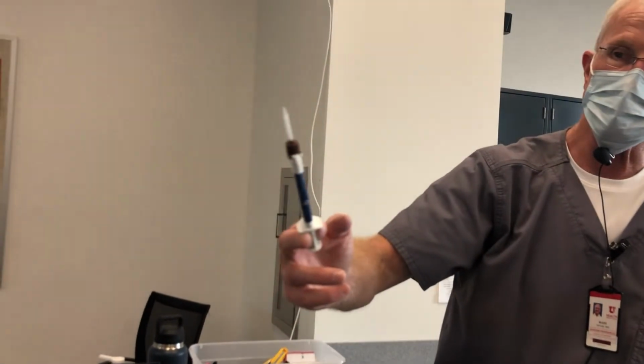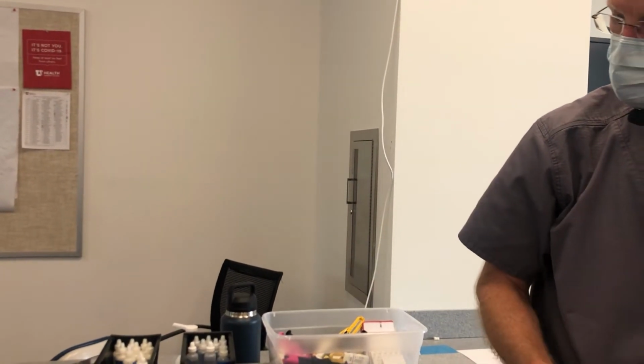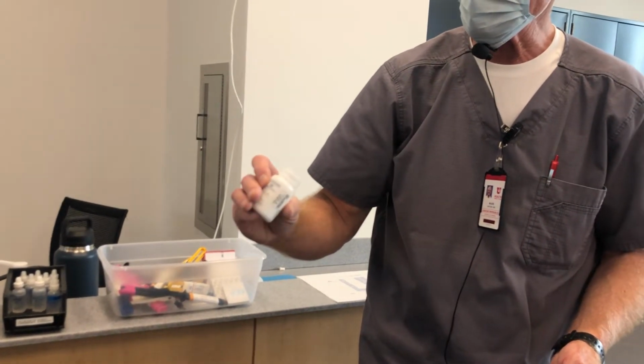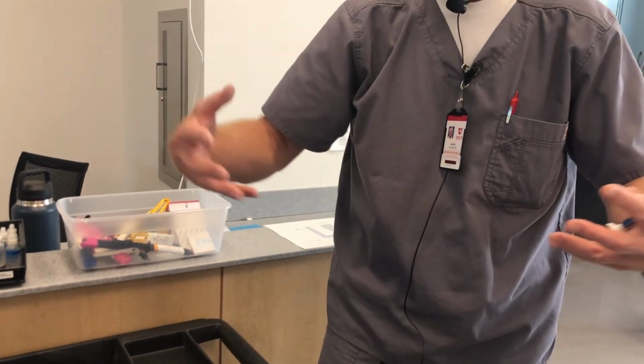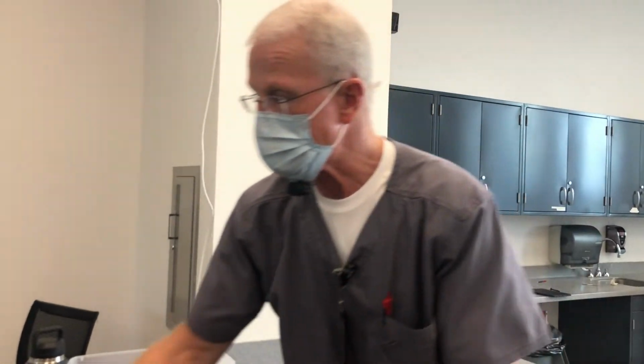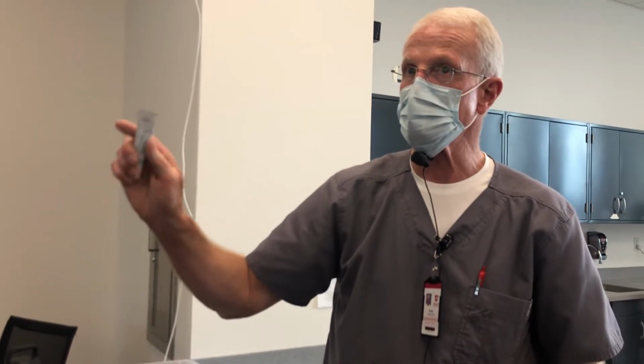There's also a syringe form of the temp bond, and it's the same basic chemical reaction as with the IRM, but the IRM has little polymers in it, like little fibers, that make it harder when it's all set. Whereas with temp bond, you don't have that, but they're both eugenol based. And then there are non-eugenol based temporary cements too. Same idea, but no eugenol for obvious reasons, especially if you're bonding.